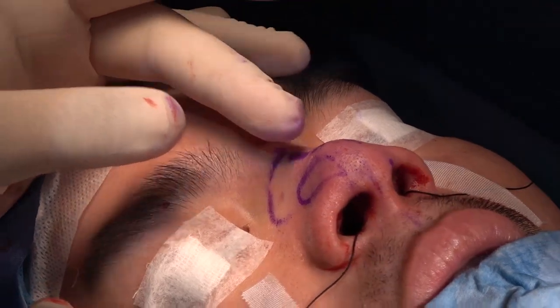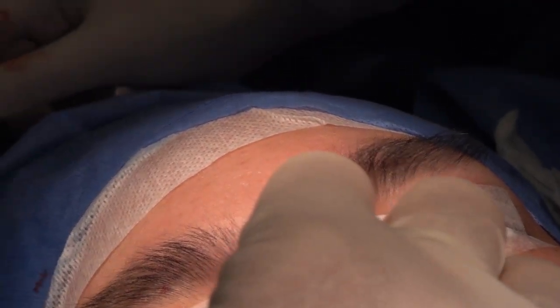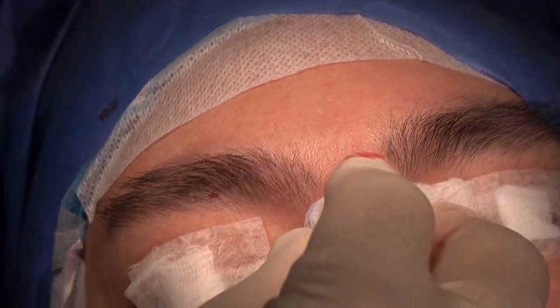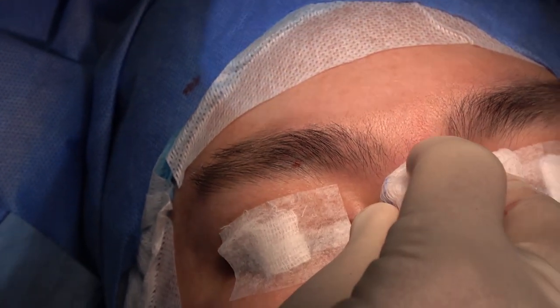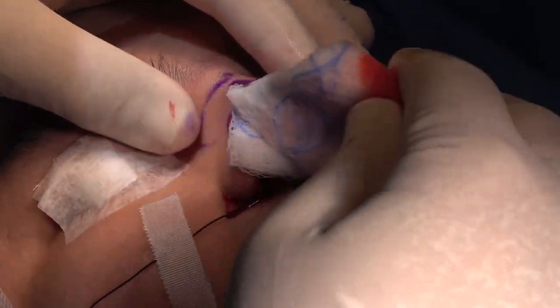Now we need to graft the dorsum. We try if we can find. What we got? Zero graft? Show me the back first. Yes. Bring the back. Can you show the back? Rib graft. Rib graft. Yeah, the rib.